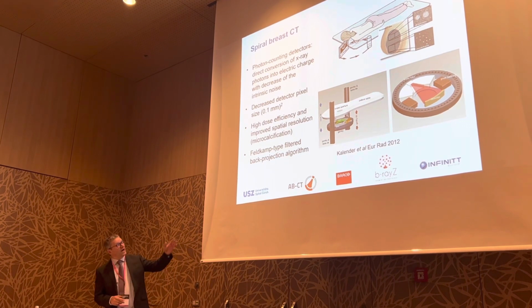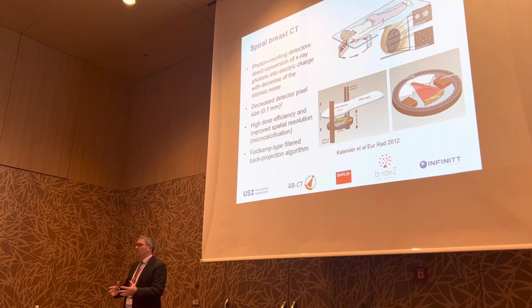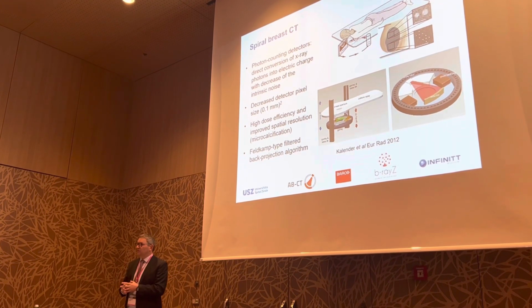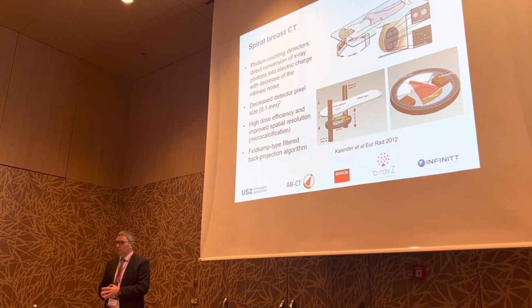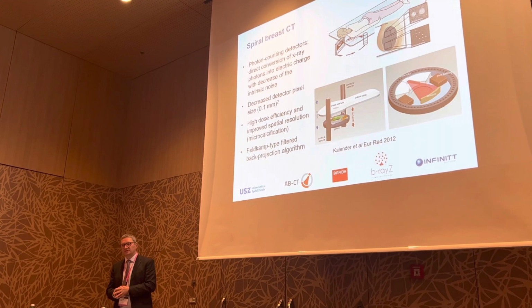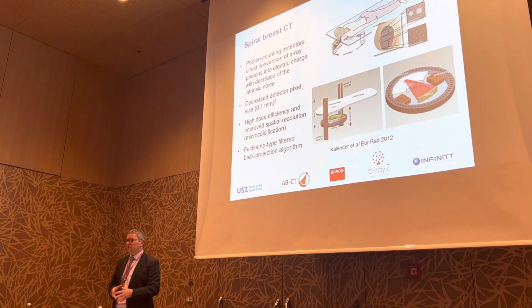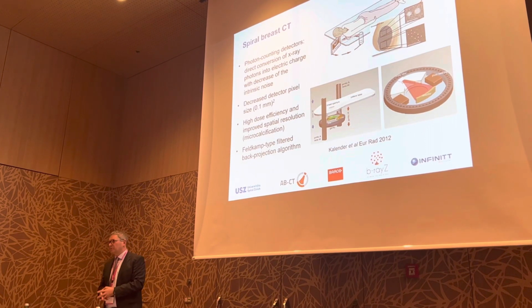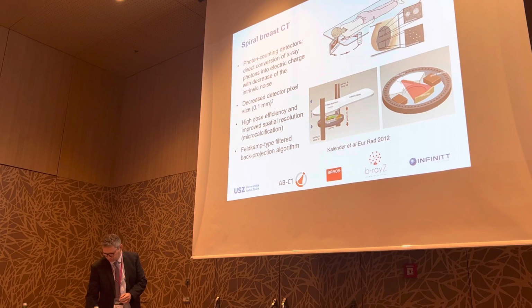From the high efficiency of the detector, it is possible to acquire 3D images at high image quality with very, very low dose, acceptable even for breast cancer screening purposes. And it's a true CT scanner, so a Feldkamp-like filter back projection is used for image reconstruction.